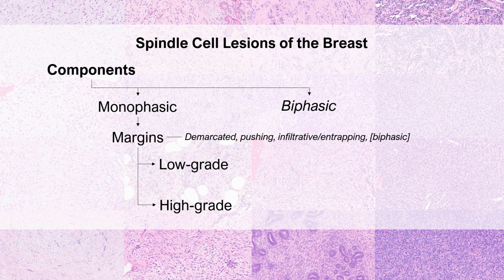Conversely, an observation of nuclear pleomorphism or increased mitotic activity does not necessarily preclude a diagnosis of benignity. Common low-grade processes may show fibroblastic or a hypercellular pattern, and this low-grade class of lesions are more likely to represent lesions that are instantly recognizable by morphology alone, as may be the case with mammary-type myofibroblastoma.